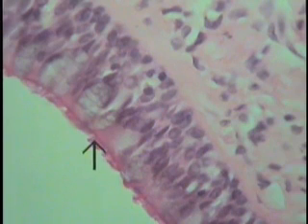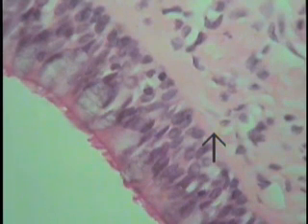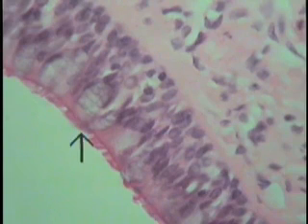Because cilia are present on some of these cells along its surface, the complete classification scheme for this type of epithelium is ciliated pseudostratified columnar epithelium with goblet cells. A little bit later on, we'll simply refer to this epithelium as a typical respiratory epithelial type.